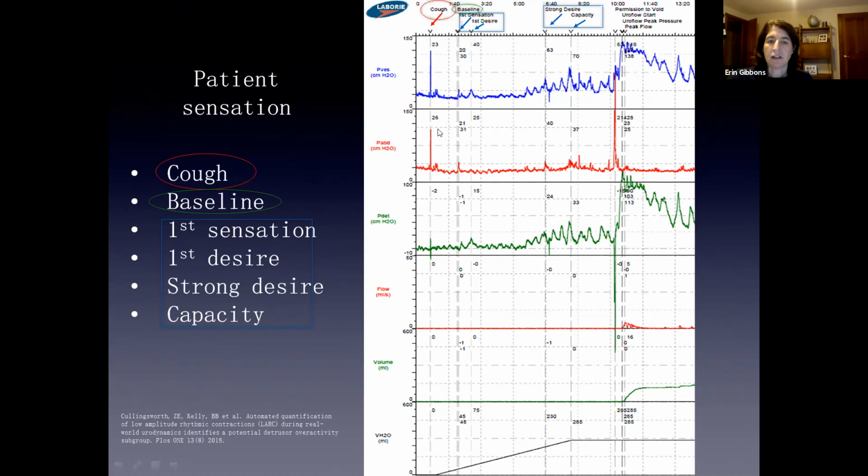The important thing to realize, which I think sometimes gets lost, especially with a nurse who is learning to do urodynamics for you, is that these numbers in the bladder and in the rectum are not going to be zero. If they're both at zero all the way down here, then you have something wrong, because the pressure within the rectum and the bladder at rest is not zero.